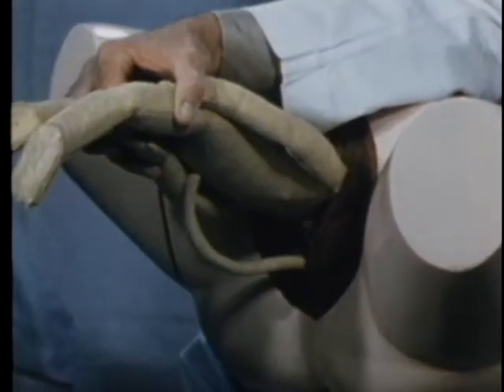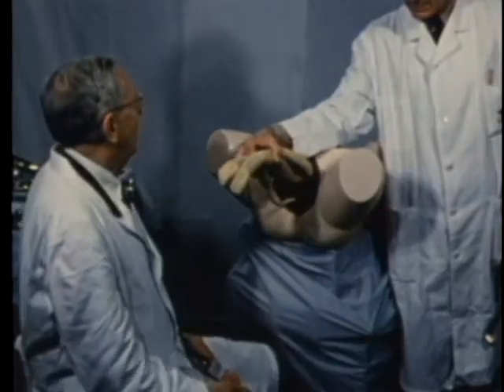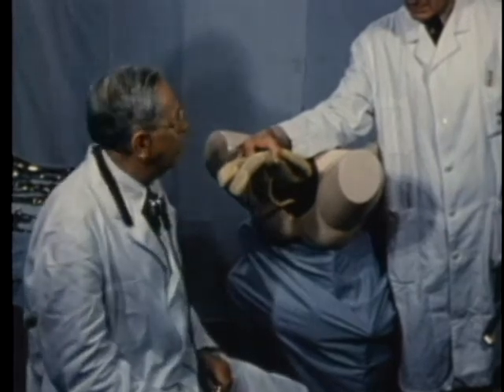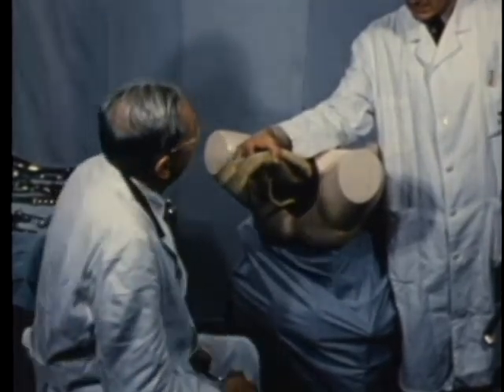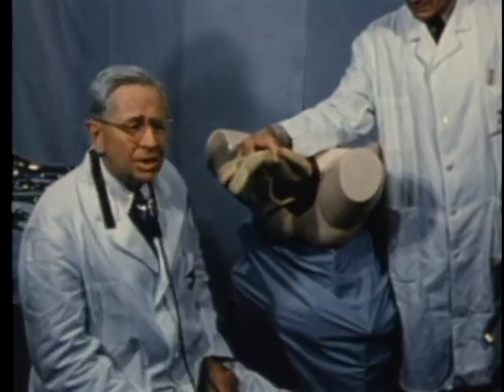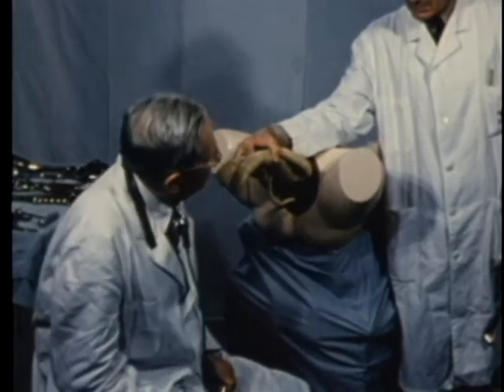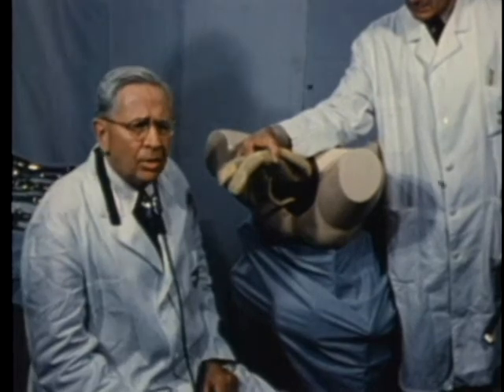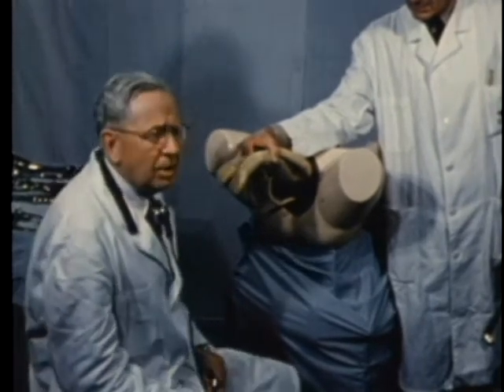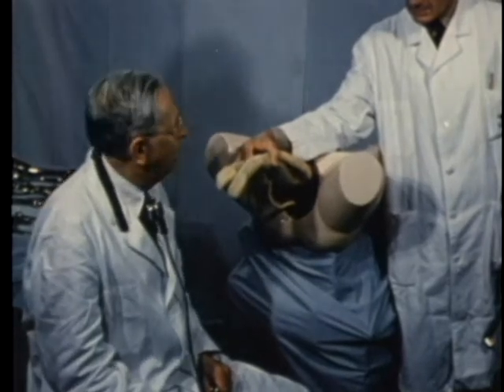Now for the technique. After the breech and the body and the arms have been delivered and the head has been brought into the pelvis by the Mauriceau-Smellie-Veit maneuvers, if there is any resistance to progress, the Piper forceps are applied to avoid the possibility of injury due to traction on the body or pressure on the aftercoming head.